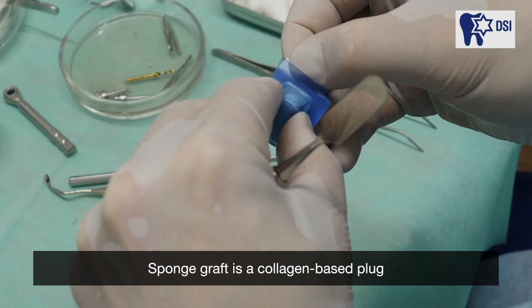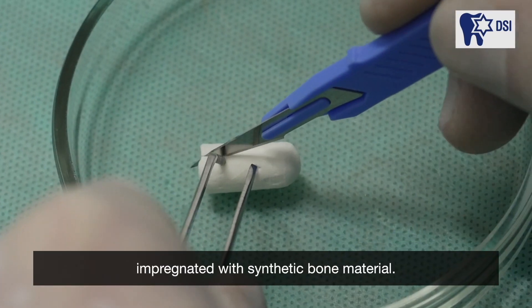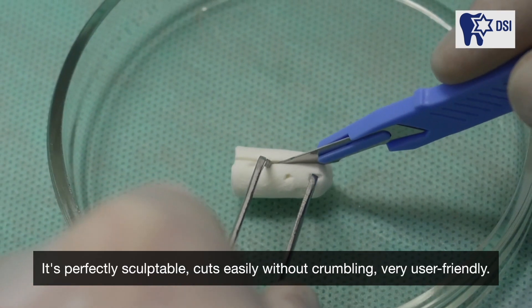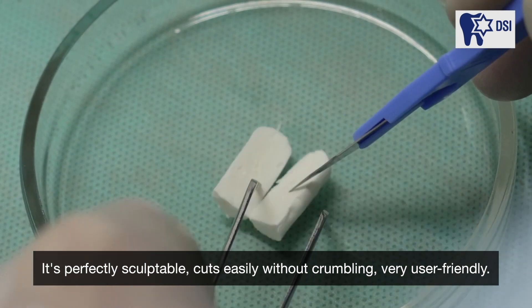SpongeGraft is a collagen-based plug impregnated with synthetic bone material. We use it instead of a membrane. It's perfectly sculptable, cuts easily without crumbling — very user-friendly.